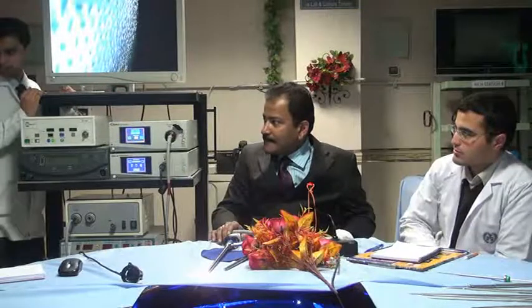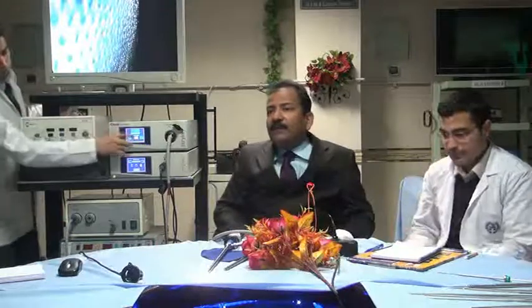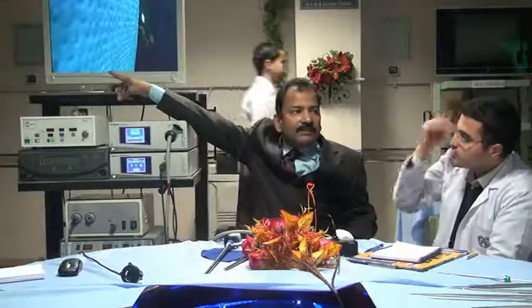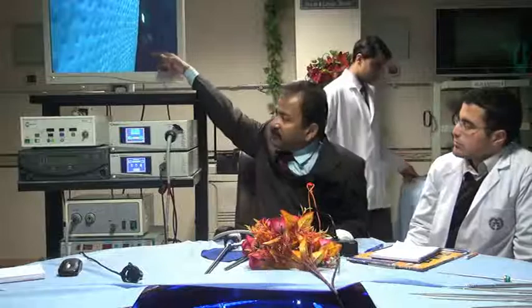It is suitable to explain what the digital and the analog mean. Digital color. Actually, in the analog system, in the past we were using the cathode ray tube. Those are cathode ray tube monitors. In a cathode ray tube, there is an electron gun which throws electrons, and there is a fluorescent spot which will give you the light. Those were analog technology. Now the technology is digital. In digital there are pixels.